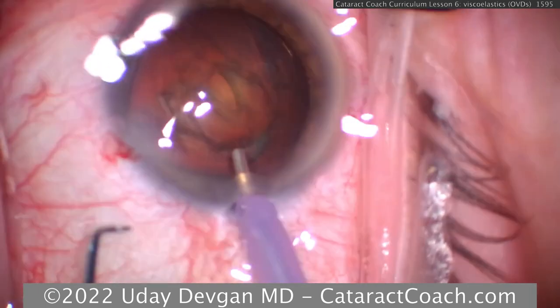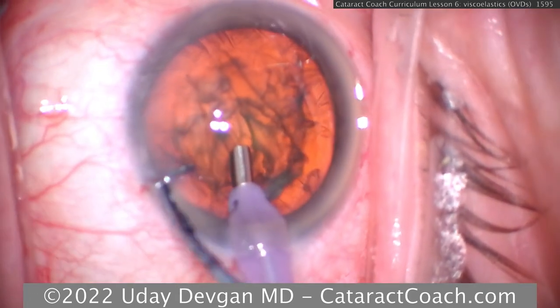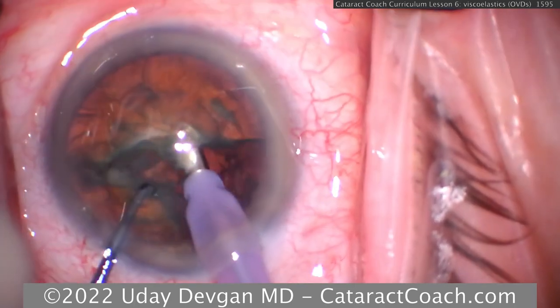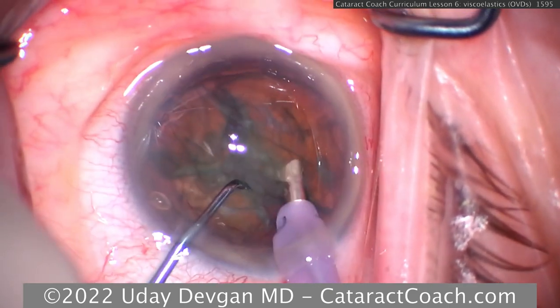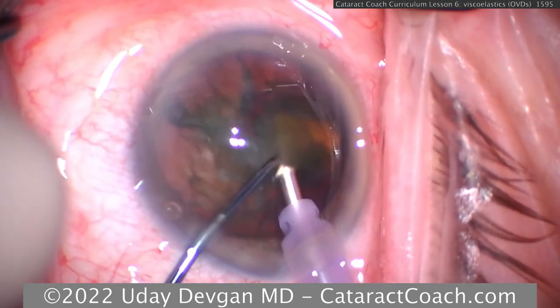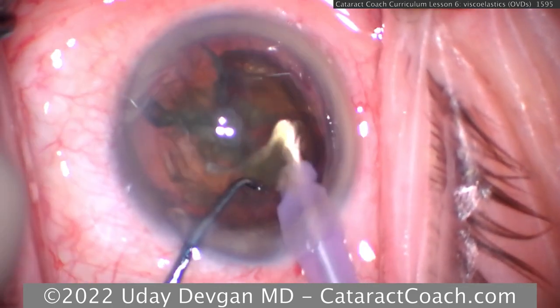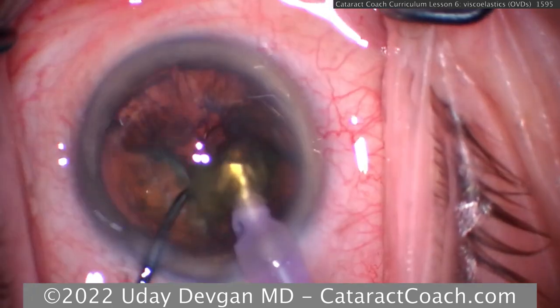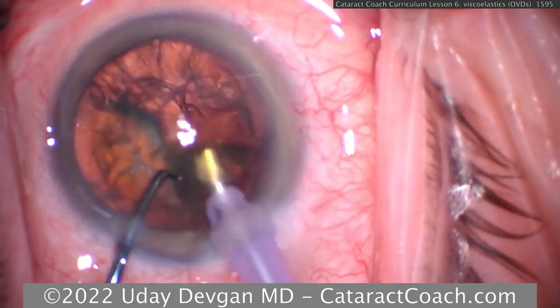A very commonly used viscoelastic around the world that's very dispersive is HPMC, hydroxypropyl methyl cellulose, which is actually derived from plants. Cellulose is in the name, right? It's the most dispersive OVD, and it's probably not the best at protecting the delicate corneal endothelium, and it can actually wash off pretty easily. So if you're using HPMC, you may have to recoat the eye or the tissues many times. Most of the other viscoelastics are actually made from rooster combs. Yeah, you heard that right, rooster combs. And if you're interested, Google more, you'll find out.